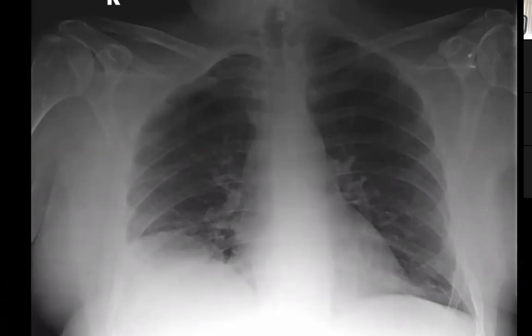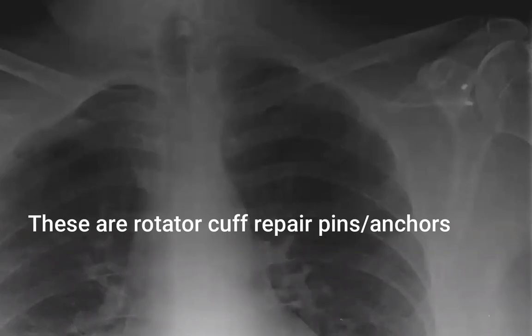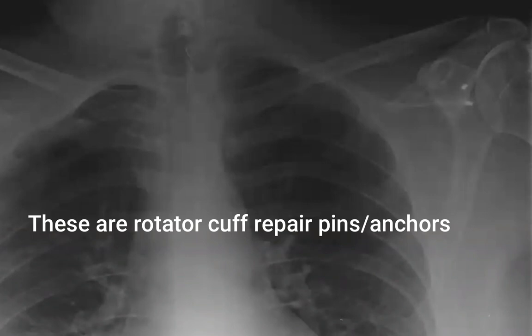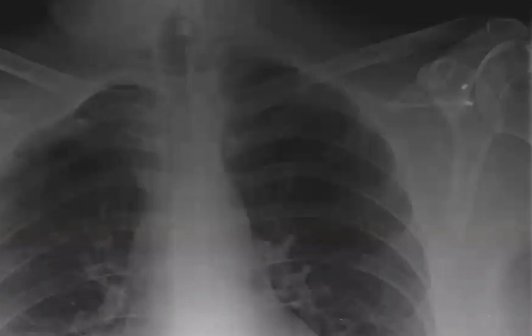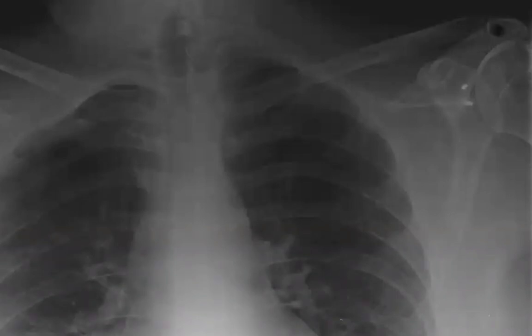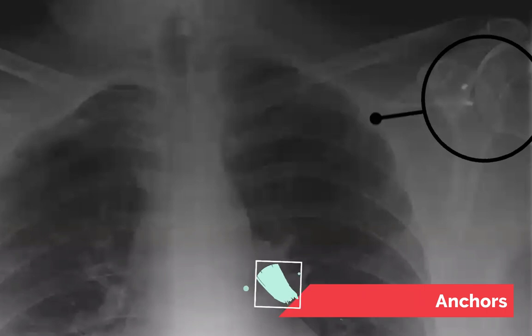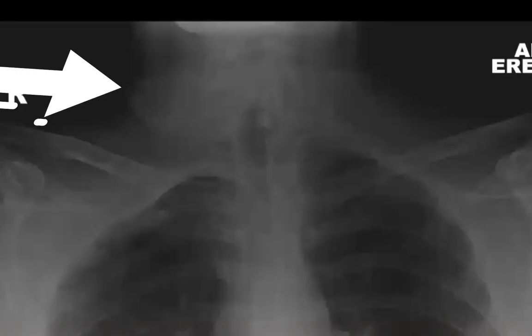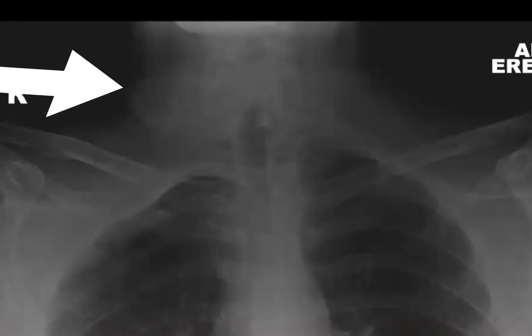The other abnormality that caught my eye is left axillary dense tiny shadows. I'd like to correlate this with any history of shoulder or axillary surgery. These are rotator cuff repair anchors. I can also see a shadow projected over the root of the neck on the right side.